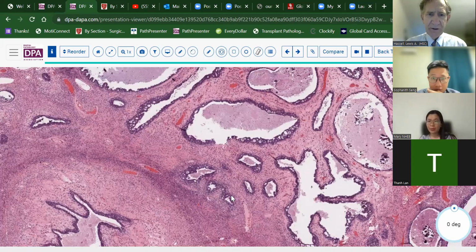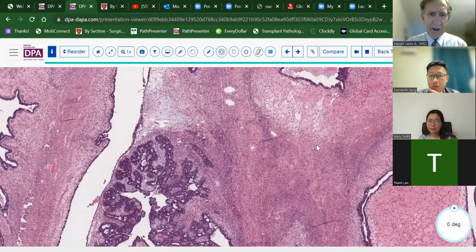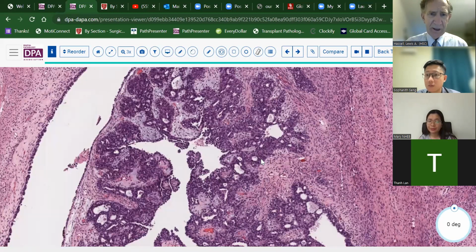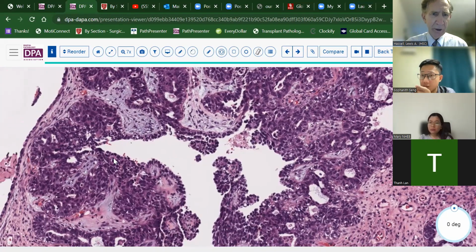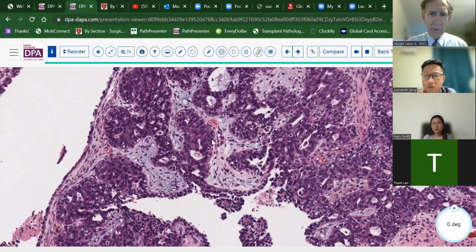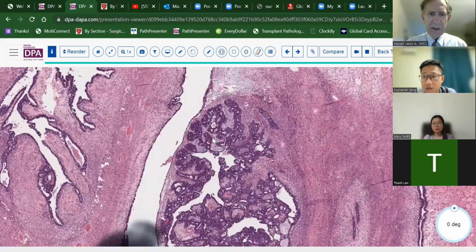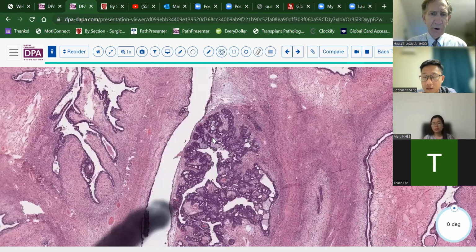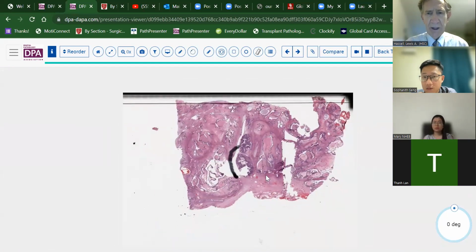And it shows up nicely through this lesion. I don't think I'd ever seen this before, or at least hadn't had a specimen to deal with. But here you can see the little bit of papillarity to it as well, with some reactive, more desmoplastic stroma around, which would be indicative of the invasion with this tumor. And I think there was some peritoneal spread of this lesion as well.